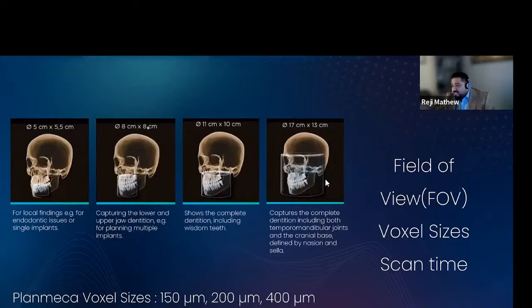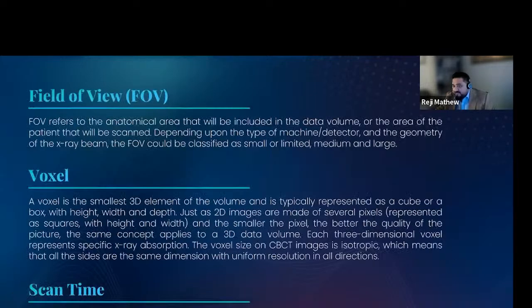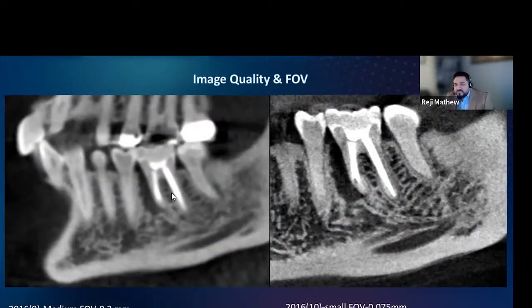So that what you measure is a very reasonable, very accurate measurement. Now I'm going to skip this slide, and I'm going to show you how a voxel size and a field of view can be a different field.